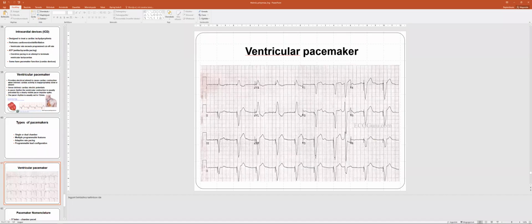Okay, good. So these kind of intraventricular devices are very useful and very widely used today. If you look at the videos, you will see several types of it that can be used, for example, to defibrillate the patient. If the patient starts to develop, for example, ventricular fibrillation or atrial fibrillation, this pacemaker or device can be activated. Or if somehow the heart is not able to generate an impulse, you can place the pacemaker inside the ventricle. These are the ventricle pacemakers.